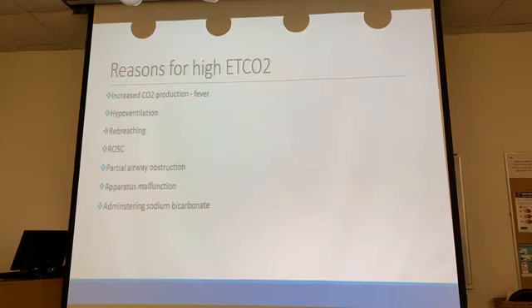Apparatus malfunction again. And administering sodium bicarb. What? I thought bicarb, you know, that's supposed to neutralize pH. That's what I said. It's gonna neutralize your pH, but remember what I told you, do not try to interpret end-tidal CO2 as the pH of what's going on with the patient.